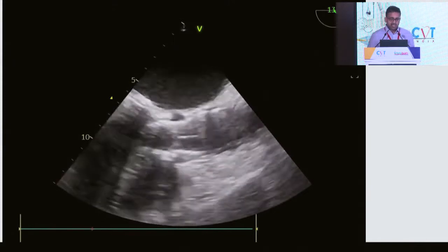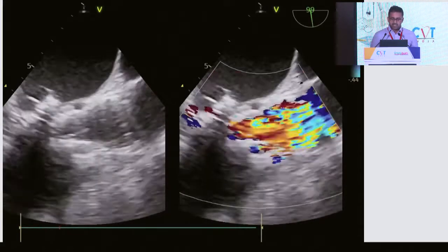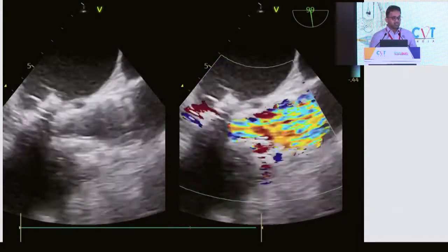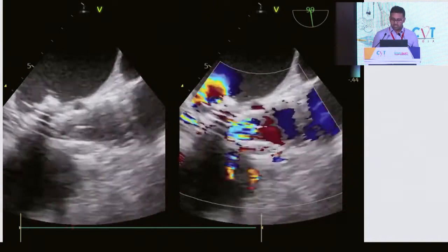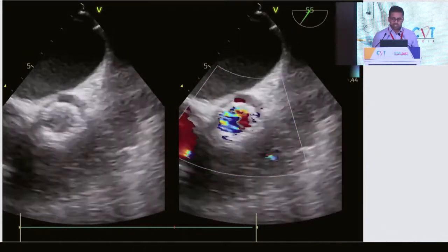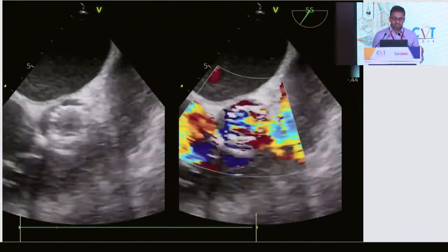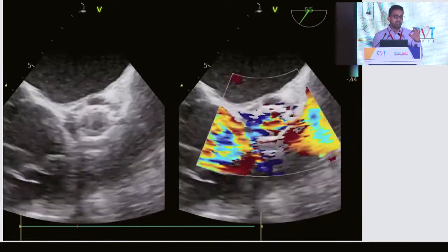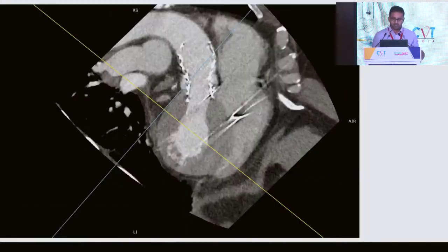This is the echocardiogram. You can see here a self-expanding valve in position, and this is his color flow. You can see here on the far end, the mitral seems to be okay in this view, and there's clear evidence of diastolic flow consistent with severe aortic regurgitation. Short axis proves the same: it's not paravalvular, it is clearly valvular, and the valve is nice and circular. Again, multiple views just to make sure we're not missing a paravalvular leak, because this is the only view on echo where you can say whether your leak is valvular or paravalvular.